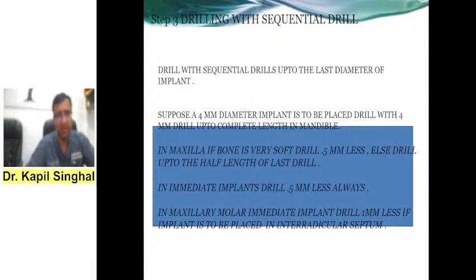What is primary stability? Primary stability is what we talked about earlier, torque. So primary stability is the torque achieved just after implant placement. It is very important that you have good primary stability if you want your implant to be successful. Okay, now the bone is soft, so I need to under prepare the diameter of my osteotomy.